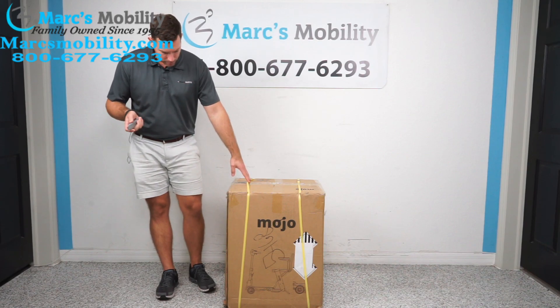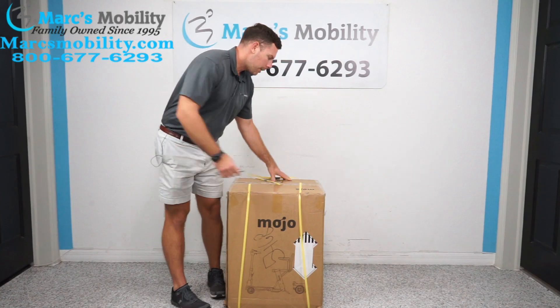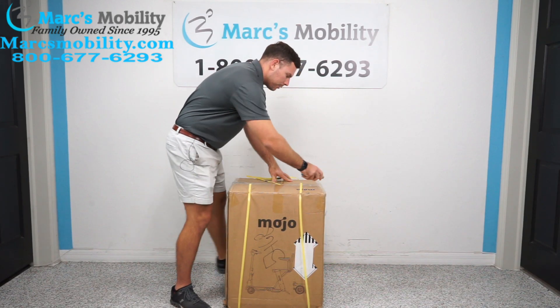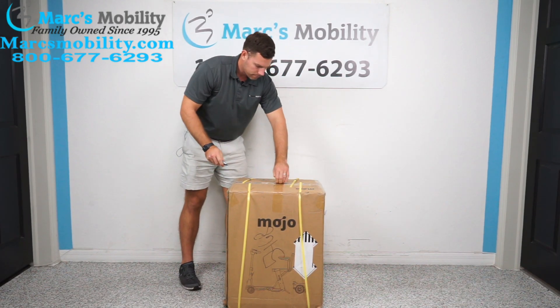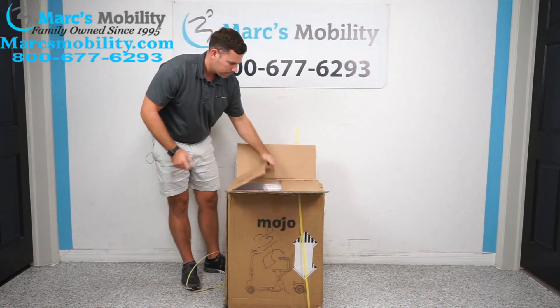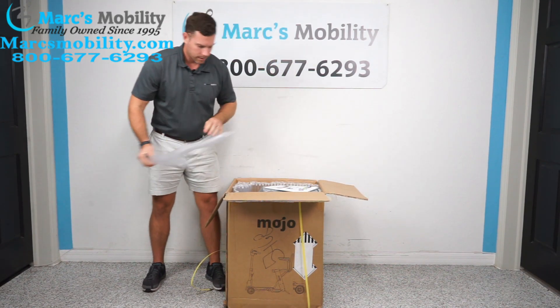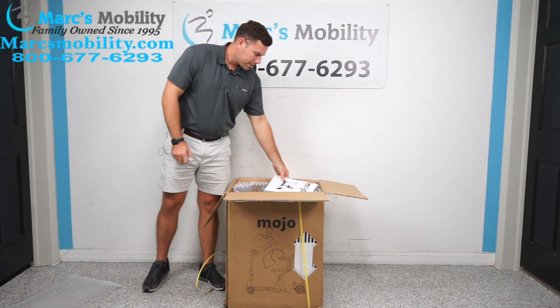I've never done one of these before — it just came out, so we are going to learn at the same time. We'll cut the box open and see what it looks like. When you open the box, it's going to have plenty of protective material on it.